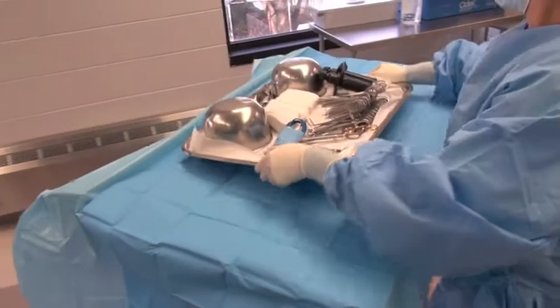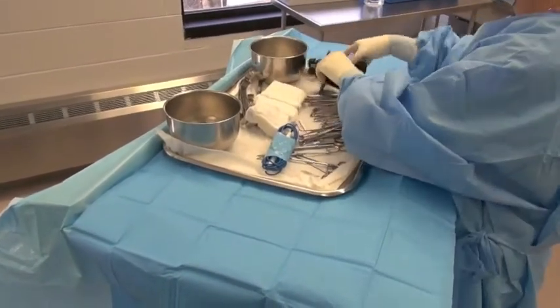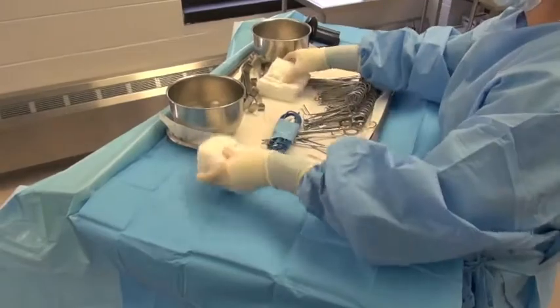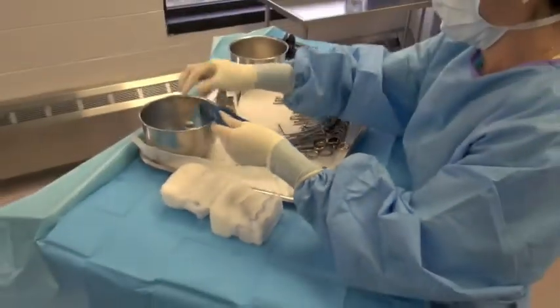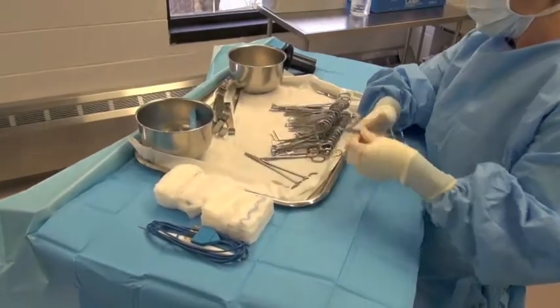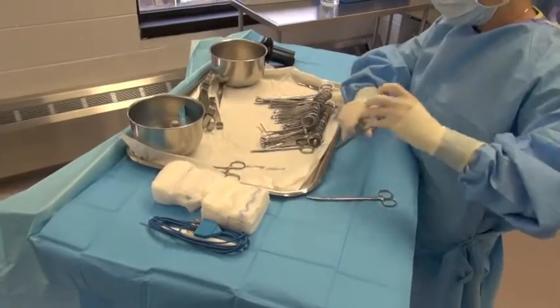This is a short video describing how to do your table setup for the feline surgery class. As you can see, this tray has a few more instruments than we typically have in your trays for the laboratory, but the principles still apply. Typically, once you have the tray open, you're going to want to arrange your instruments along the table.